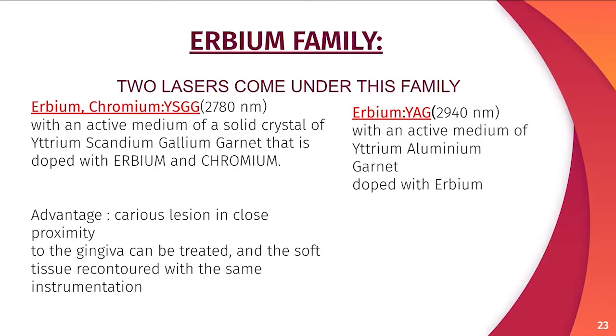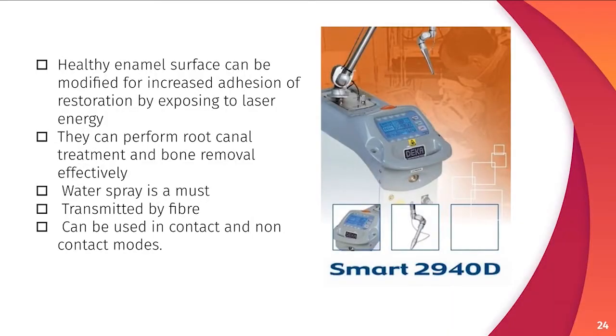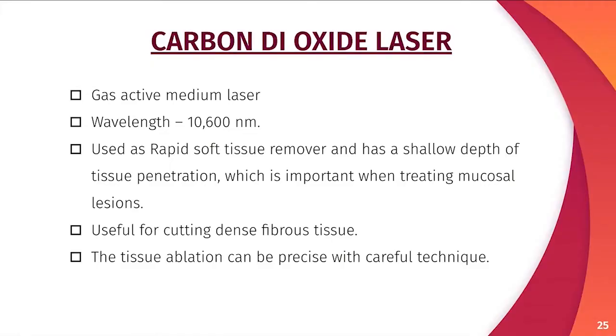Erbium family. Two lasers come under this family, erbium chromium YSGG and erbium-YAG. We can perform root canal treatment and bone removal effectively with these lasers. Water spray is a must, transmitted by fibers. Can be used in contact and non-contact modes.